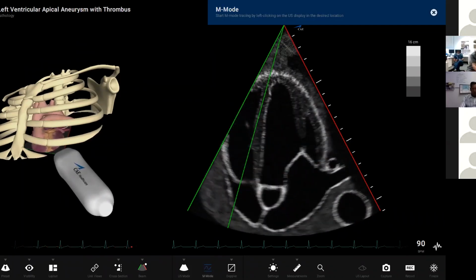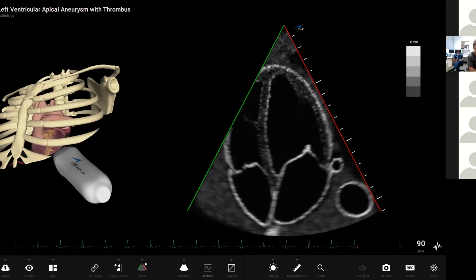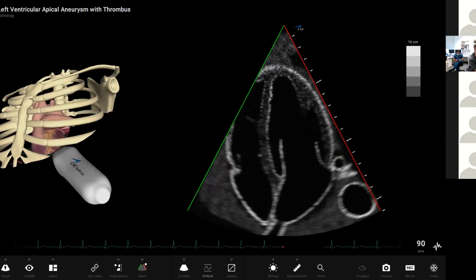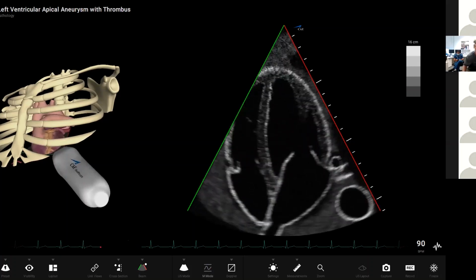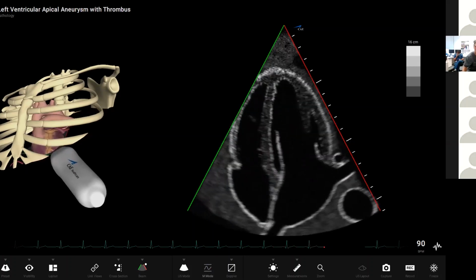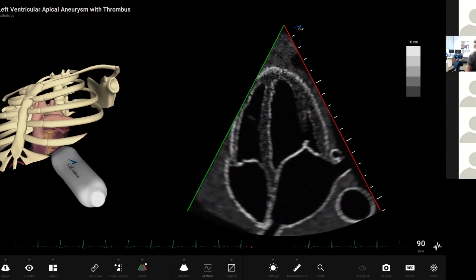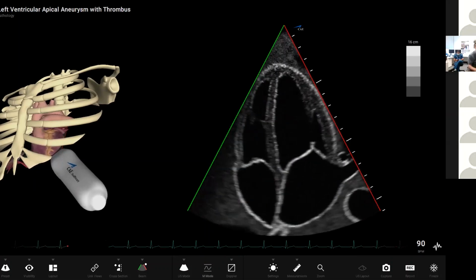Two other things you can do. Obviously change the baseline and move that second HPRF sample volume out of an area where there's any blood flow. If it's really deep and you can't get rid of the second HPRF volume, move it right up over the proximal LV apex where there's no blood flow, or over the myocardium. I didn't know you could actually move those. I thought they were fixed. Yeah, usually you can move the second sample gate. If you're in high pulse repetition frequency, you can usually take that second sample gate and move it. Something I used to get us to do is put it right over the LV apex where there's no blood flow. Nice. Okay, thanks. Sounds good.